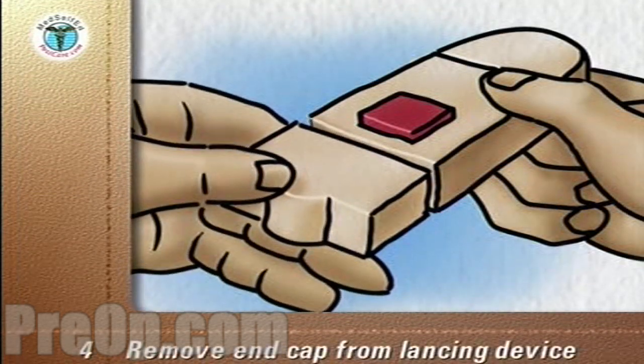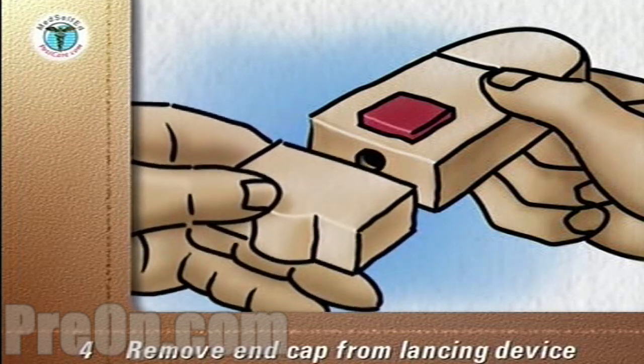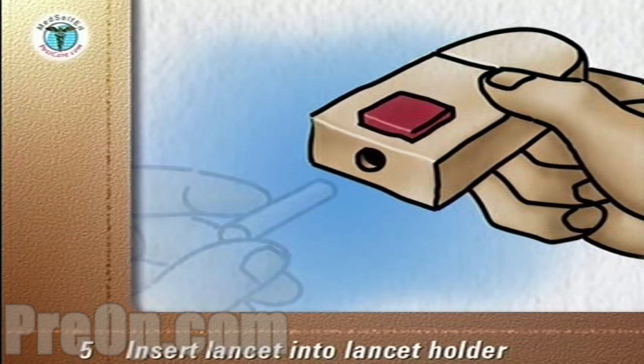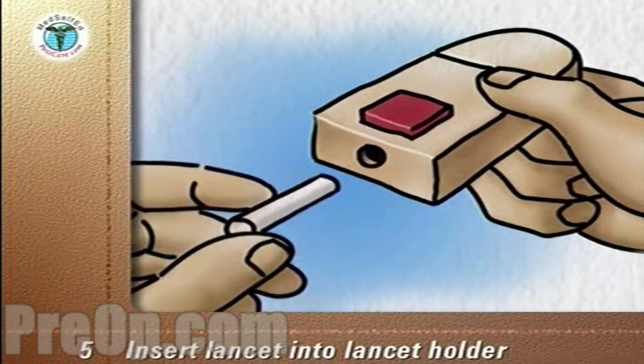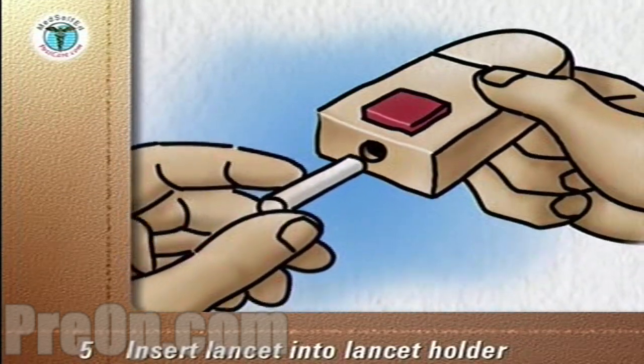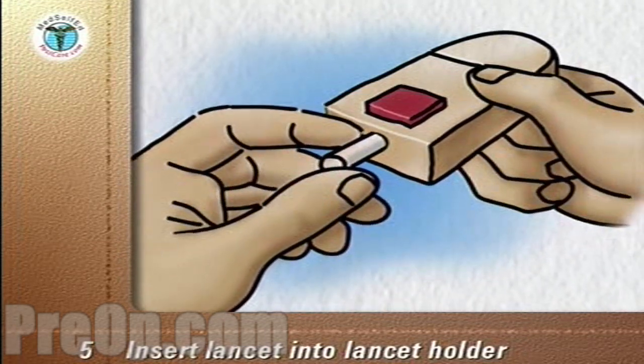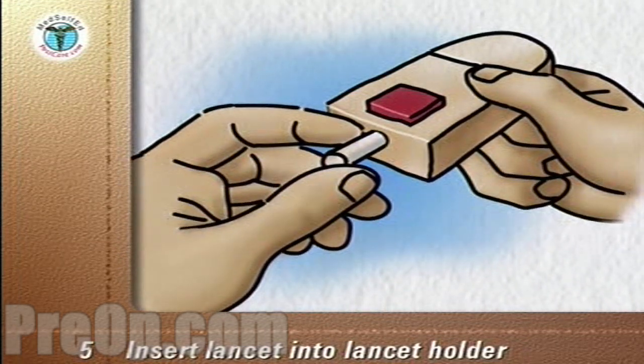Remove the end cap from the lancing device. Insert a short lancet into the lancet holder according to the manufacturer's instructions. Twist off the protective cap and save it for the disposal of the used lancet.